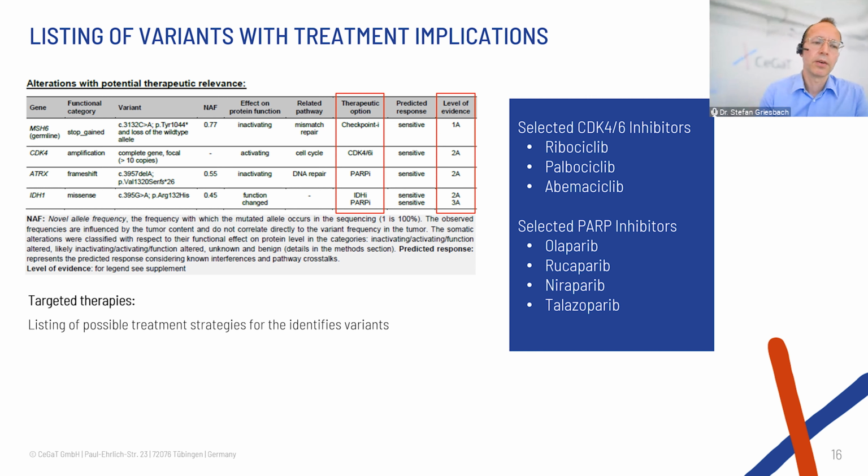And you see there's copy number variants, like for CDK4, we have an amplification, at least 10 copies. It's a CDK4/6 inhibitor sensitive, and this list goes on. And you can actually then say, okay, based on these results, I do have a couple of options to treat my patient. And then you can see what other markers are there for the patient, or what other needs are there for the patient, which is available. And then you can choose a treatment appropriate on that setup.